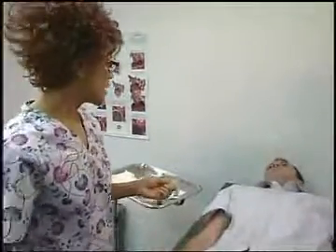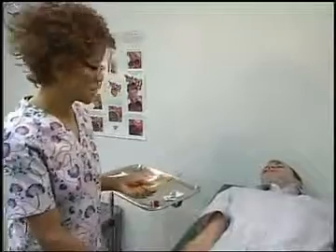Mike, have you ever fainted before? No, not that I can remember. Well, I'm going to ask you to stretch out on the table anyway. Is one arm better than the other for finding a vein? If there is, I don't know. Okay, well, we'll just use the right, okay?